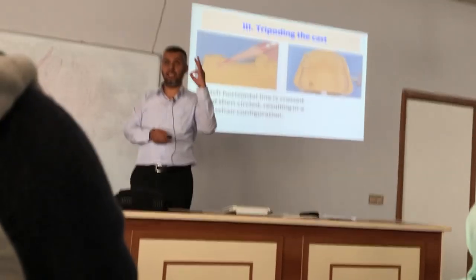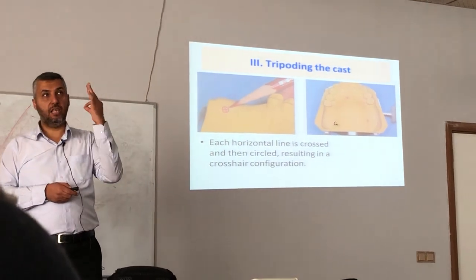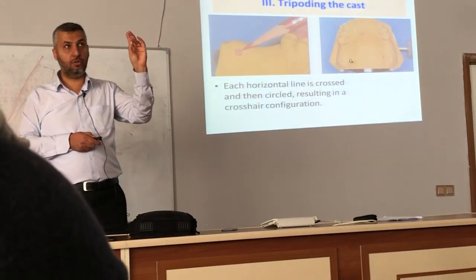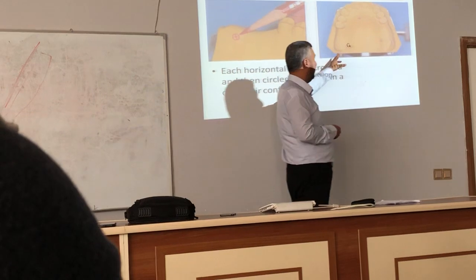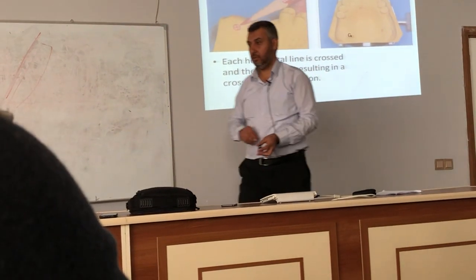Tri, it's a Latin word, means 3. Not 2 and not 4. Even if 4, it's acceptable, but the minimum is 3 points.